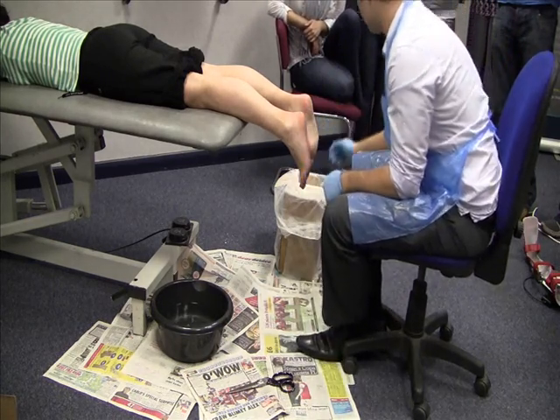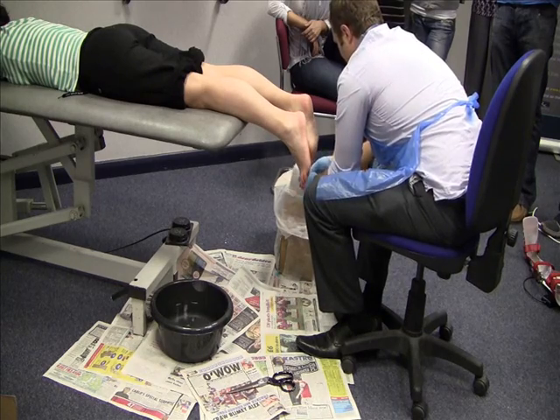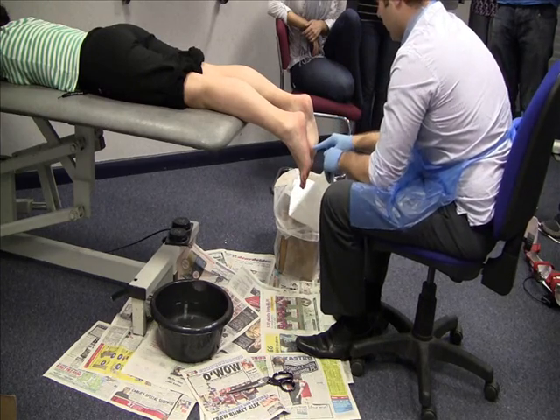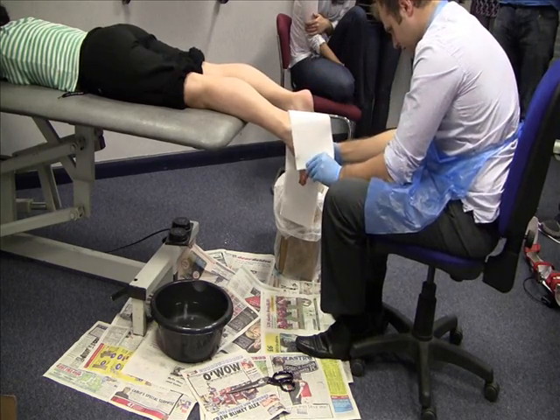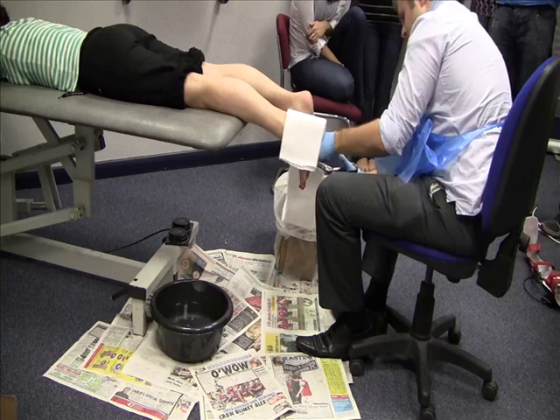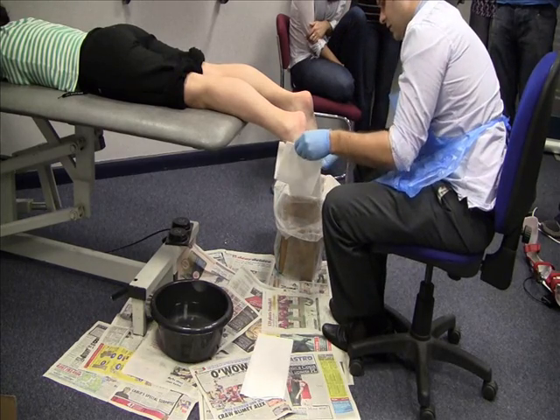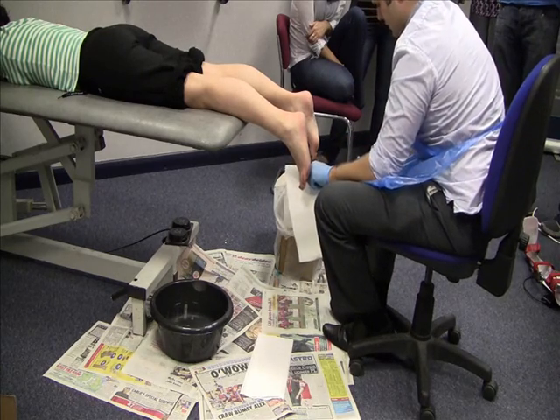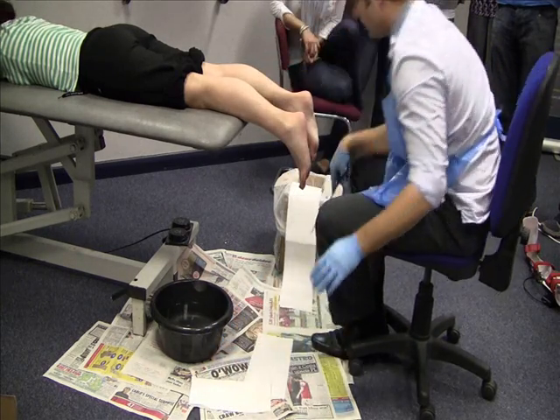Preparation. Always double up your plaster. I measure around from the first to the fifth metatarsal. First to the fifth. Take your strip off and get that ready. And then mid-arch to styloid process. Cut your piece off and put it to one side, just in case you drip over it.